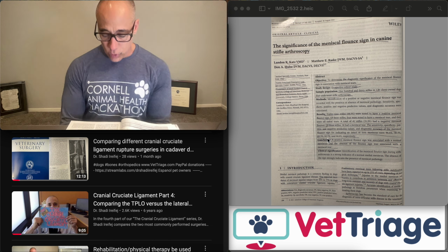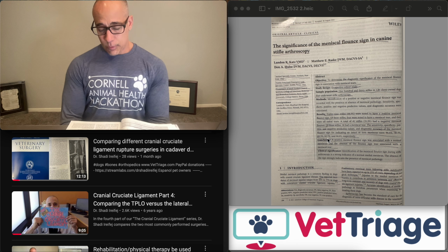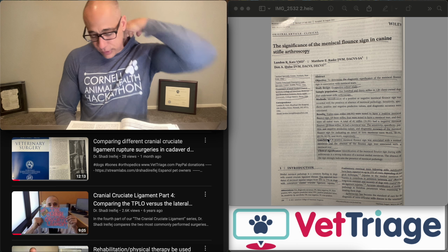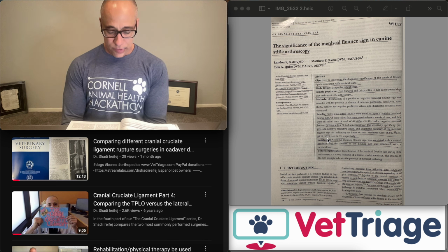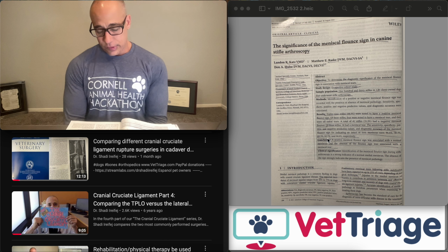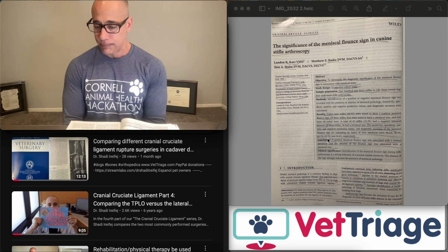Small radial tears of the caudal pole of the medial meniscus was noted in 4 stifles. All 4 stifles also had a positive flounce. This may be because small peripheral radial tears do not cause enough disruption of the meniscal fibers to eliminate the flounce sign. In people, the sign can be present in several different regions of the meniscus depending on the individual. Another study found that medial collateral ligament laxity can alter joint mechanics and the appearance of the sign.